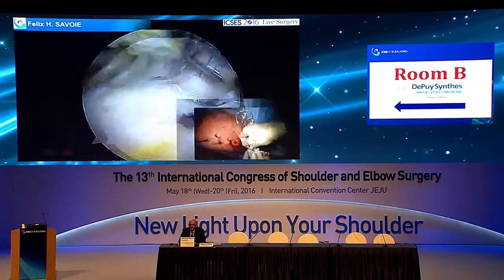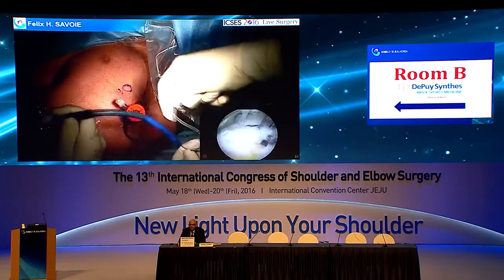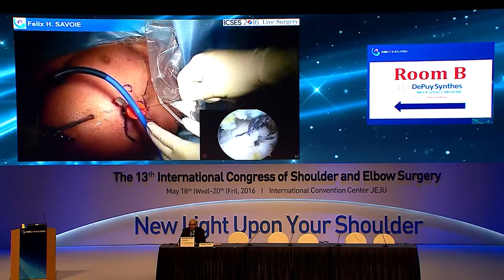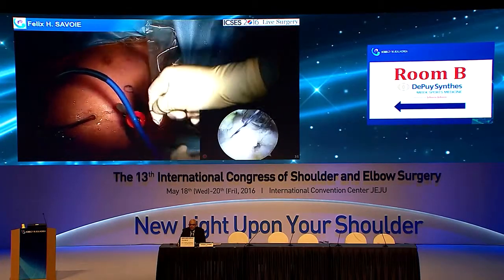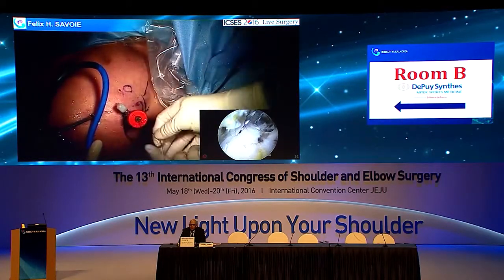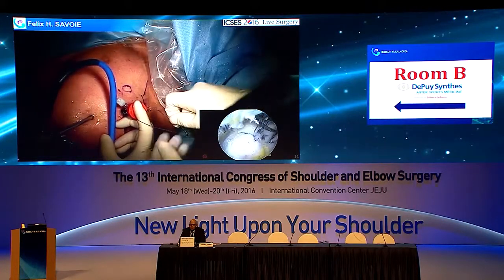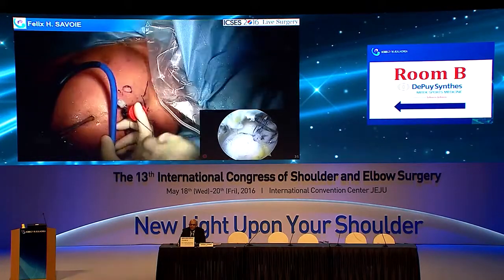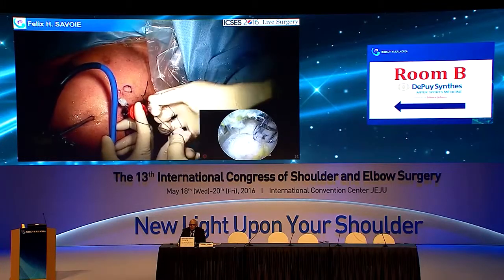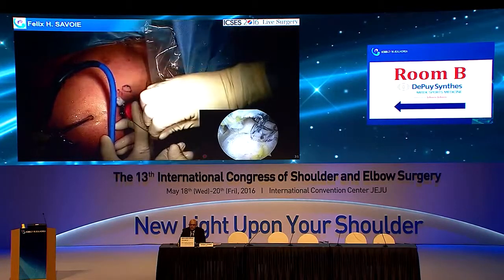And then we decide which one's going to be our post. We want the front one to be the post on this one. So we're going to change because when we do our second row, we want to pull this front part up to the anchor. What we should be able to do, can you put a finger right there for me? Thank you. What we should be able to do is close off the joint just by tying our medial row of knots. And so we'll pull all this in.